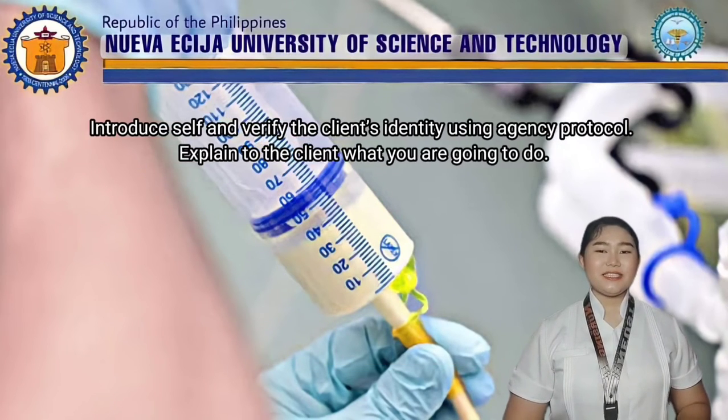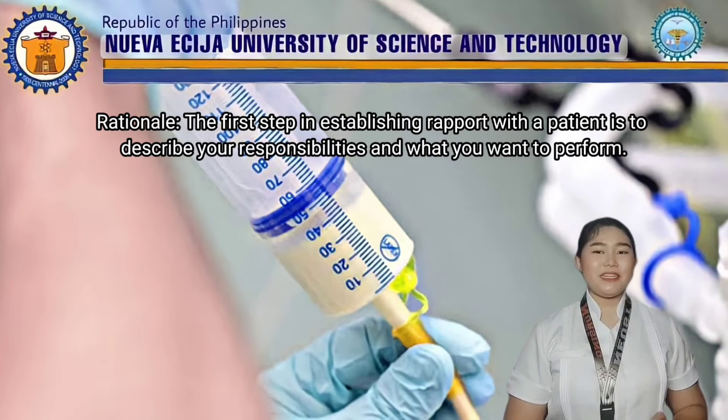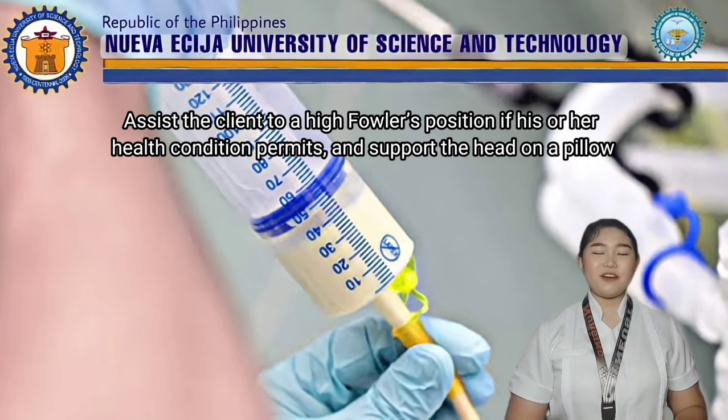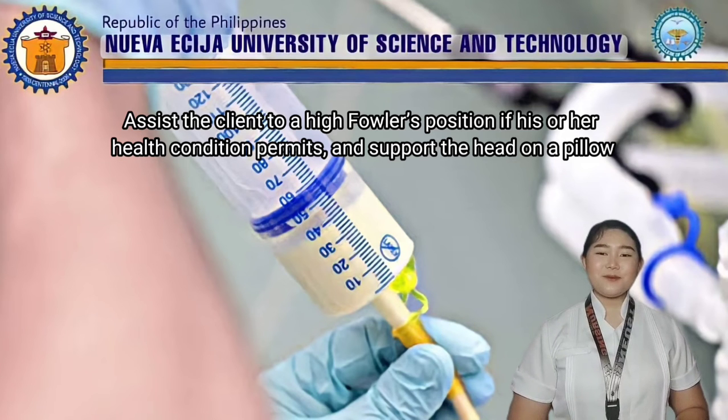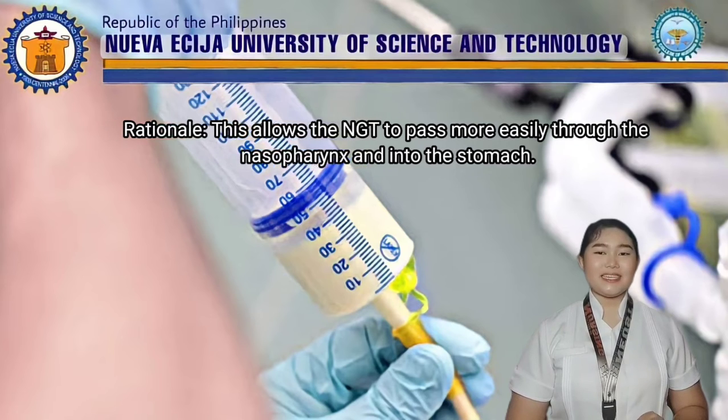Implementation. Introduce self and verify the client's identity using agency protocol. Explain to the client what you are going to do. Rationale: the first step in establishing rapport with the patient is to describe your responsibility and what you want to perform. Assist the client to a high Fowler's position if his or her health condition permits, and support the head on a pillow. Rationale: this allows the NGT to pass more easily through the nasopharynx and into the stomach.